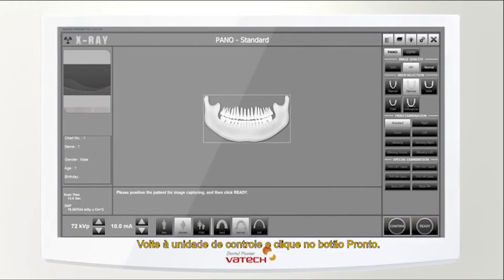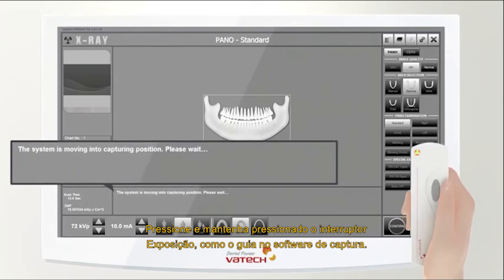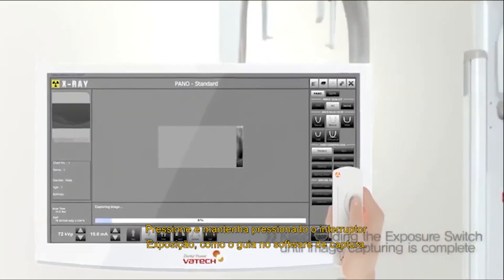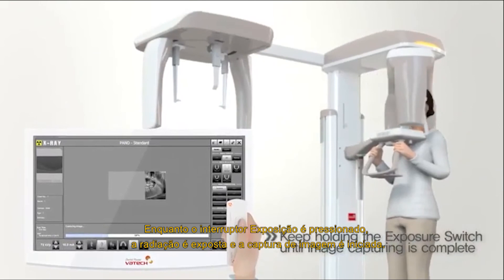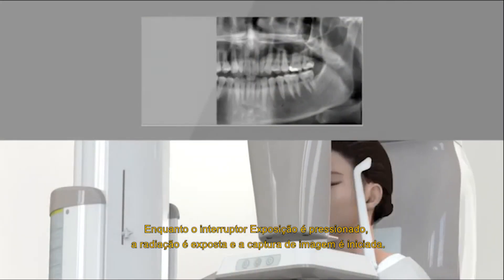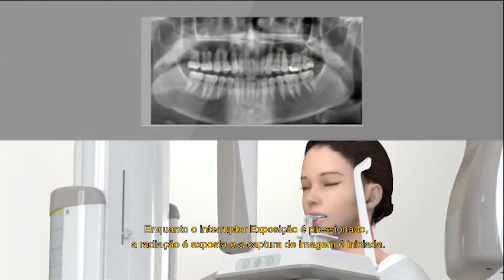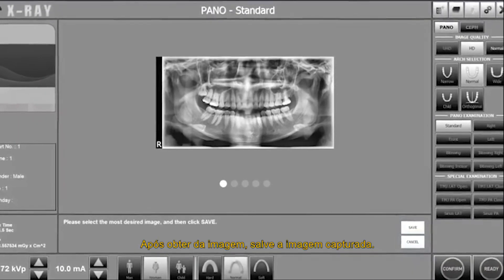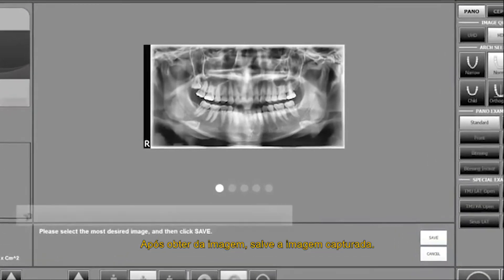Go back to the control unit and click the ready button. Press and hold the exposure switch as guided in the capture software. While the exposure switch is held, radiation is exposed and proceeds taking the images. After the image acquisition, save the captured image.